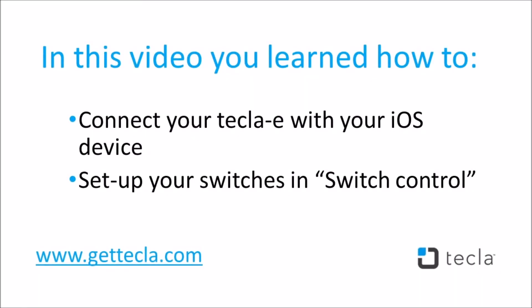In this video, you learned how to connect your Tecla-E to your iOS device and set up your switches and switch control. Now you are ready to start using your iOS device with your Tecla-E.